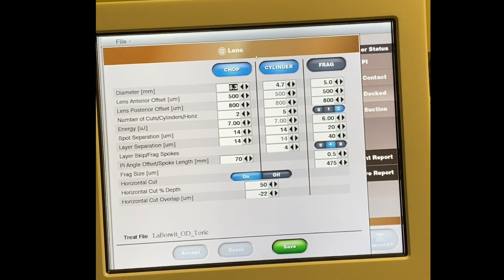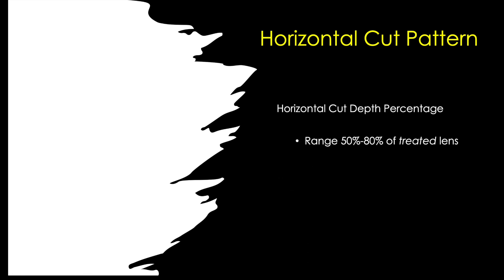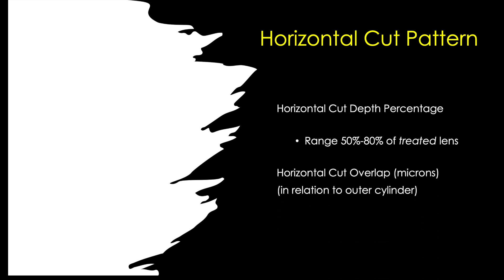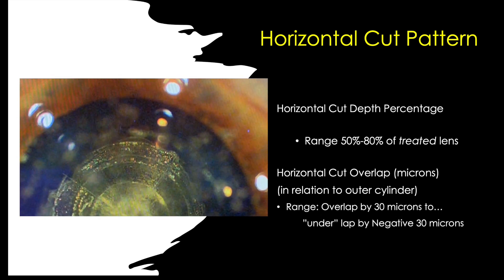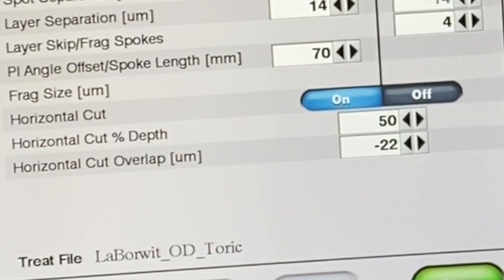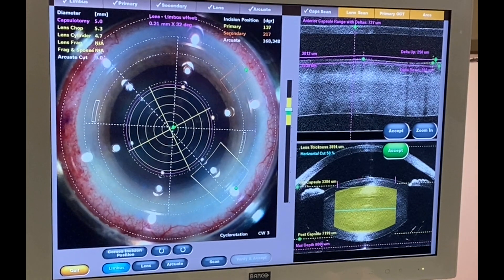This is the screen showing at the bottom the new horizontal cut that you can now turn on. The horizontal pattern can be between 50 and 80 percent of the treated lens as far as the depth in the lens where it makes that cut. The horizontal cut overlap is in microns between 30 overlapping or underlapping. In this case I use 50 percent depth and minus 22 on the horizontal.